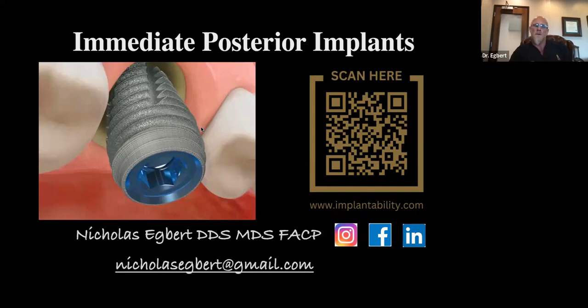The custom healing abutment, as long as it's highly polished, obstructs that bone graft, supports the tissues. Yes, that's going to epithelialize underneath, but typically the body will always form that biologic width of 3 to 4 millimeters of tissue immediately under that custom healing abutment. Hopefully that makes sense.